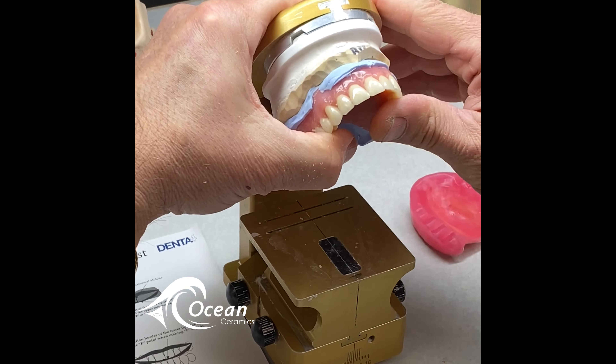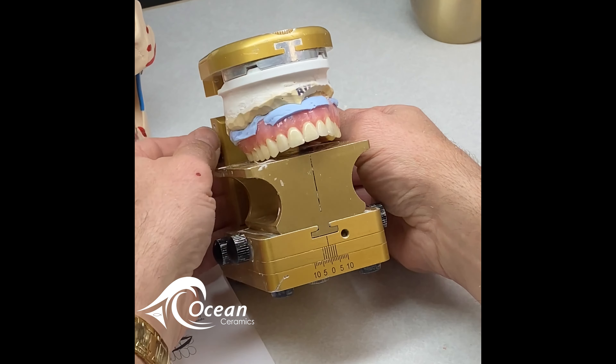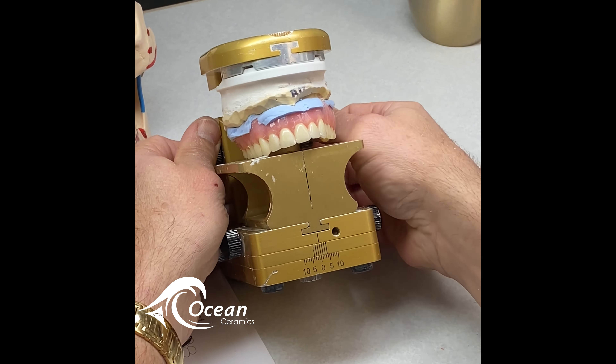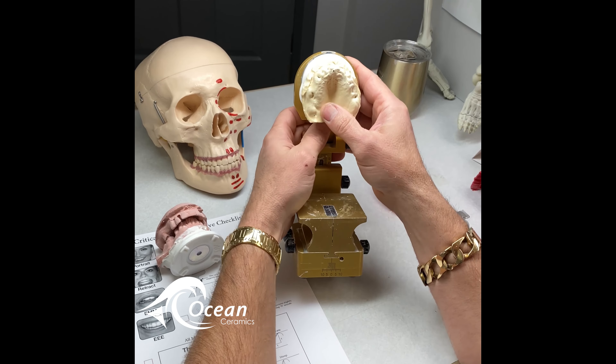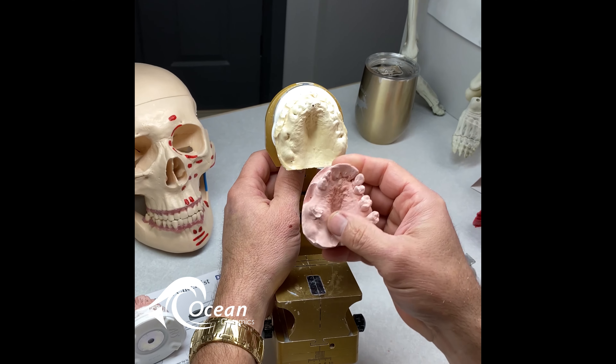I wanted to show you this case because all bite blocks are not created equally. This originally started off as a case we received like this — upper and lower models, 100% over-closed, biting up into the palate — and the doctor wanted an immediate upper denture.